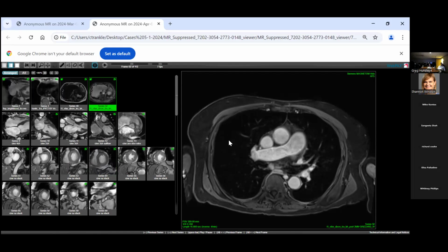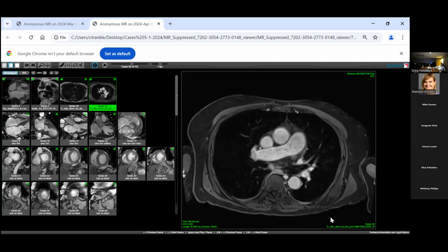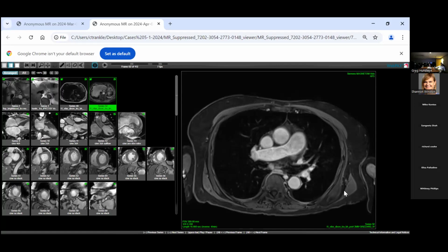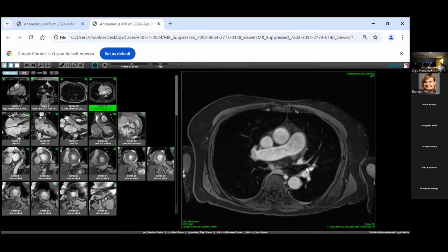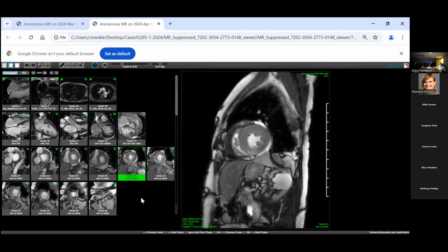You've got your field of view, which is the entire space that you're going to image here. Really, the entire space that you have to cover for the size of the patient. That's the field of view. And then how many lines we're going to put in there. And that works for all the static imaging. Okay. Next, in cardiology, we've got to make a movie, right?